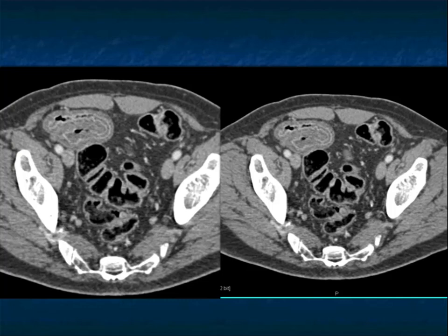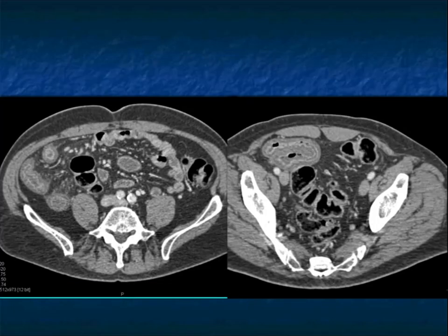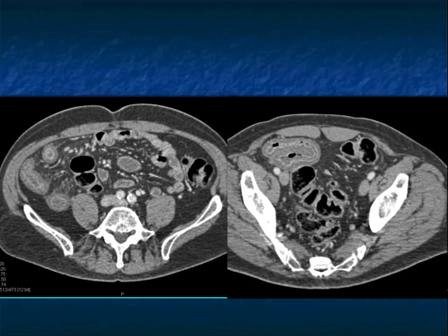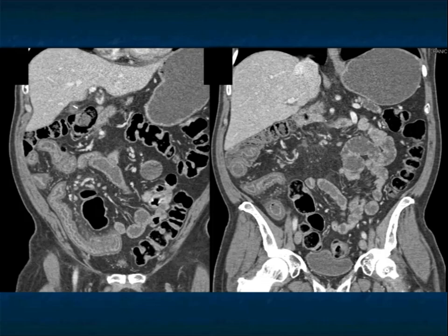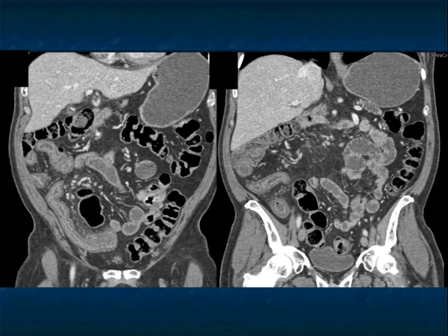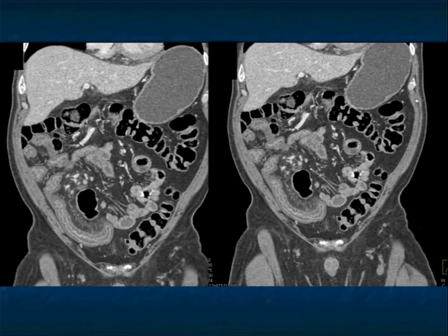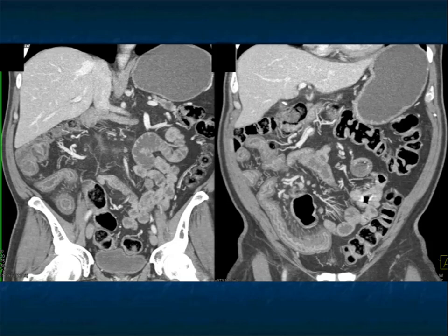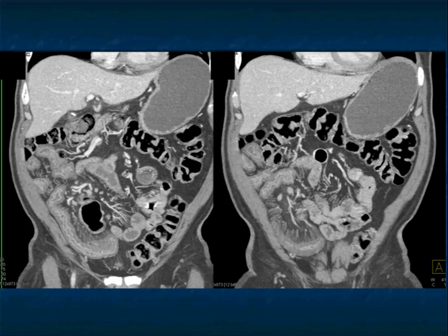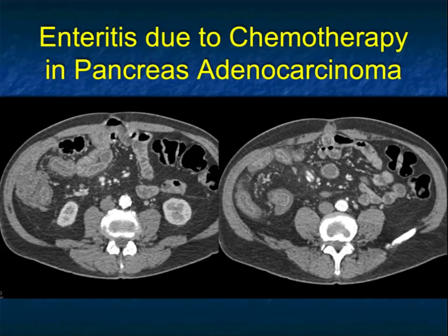If I told you this was graft-versus-host disease, you'd surely be thinking about it. But this patient did not have a bone marrow transplant — this patient had a Whipple's procedure and now has abdominal pain. With a Whipple's procedure, you're involving the region of the portal vein, SMV, SMA, and celiac, so you could worry about vessel occlusion and bowel ischemia. Maybe the patient has superimposed Crohn's disease. But what exactly is giving you this extensive bowel involvement?